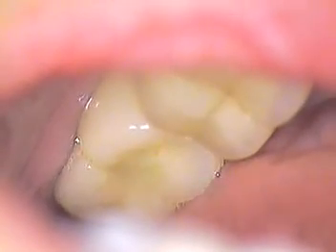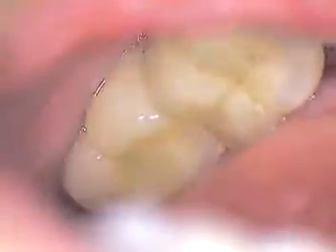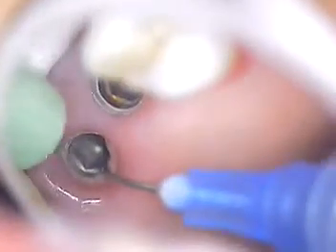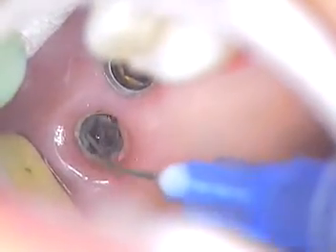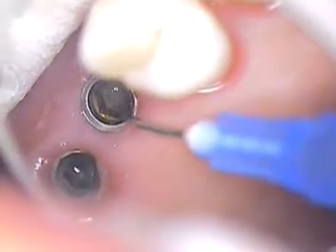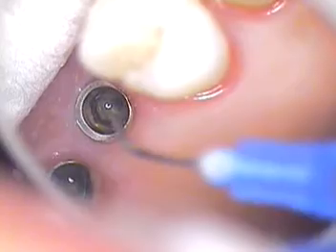Here's the TNS. I'm going to go with another one of those blue tips, just like for bonding. This is our tartar and stain. Suction just to be nearby that area. And we'll just let it go in gently, like so. Let me know if there's anything that bothers you — I'm just going to let that sit.